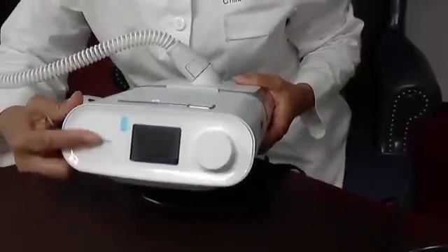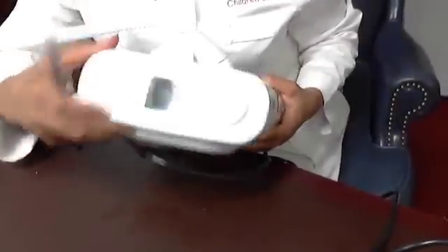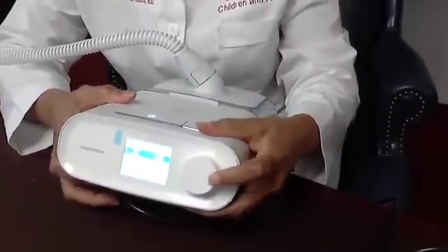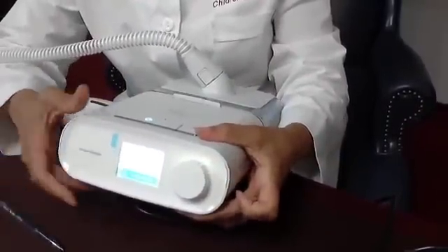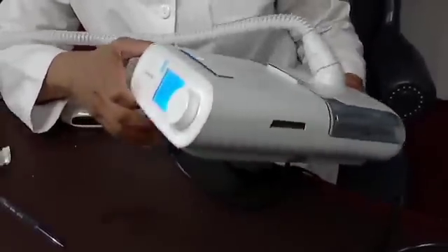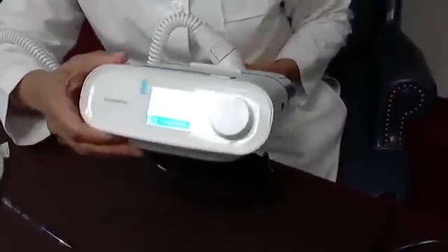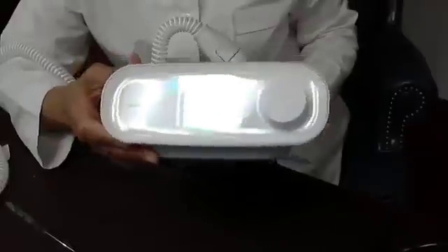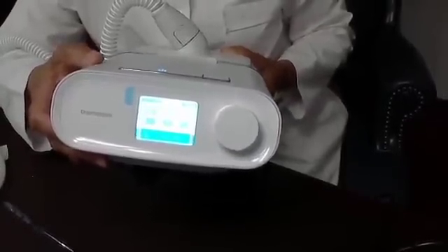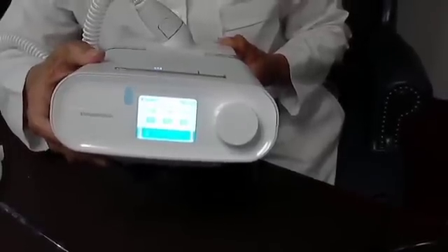The front of the machine has a window and a button. This button allows you to access the many features that this machine offers. One important feature is called My Info, which is what we're displaying now. This feature allows you to look at your compliance for one day, seven days, or 30 days.